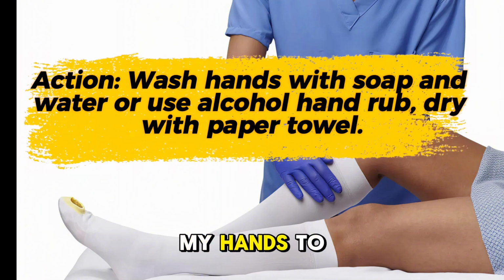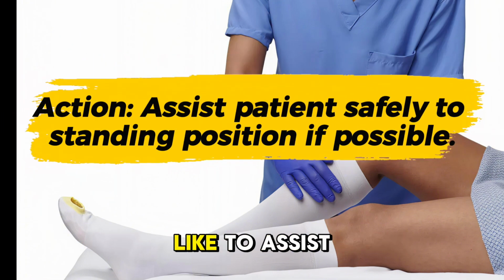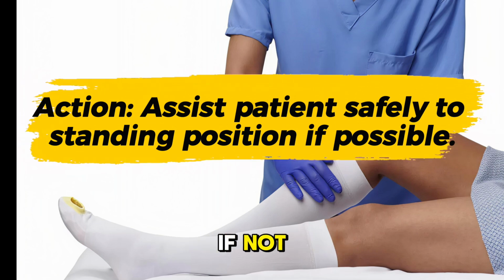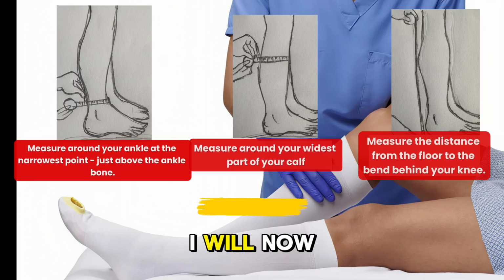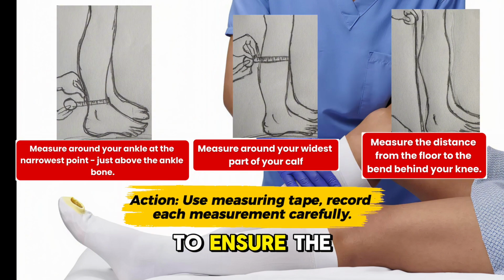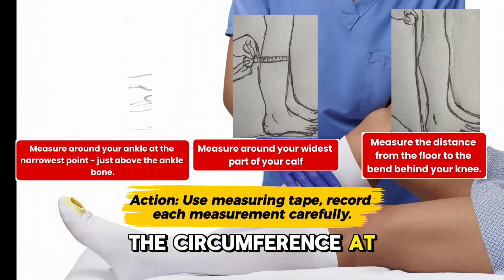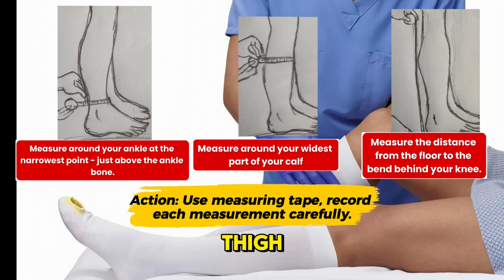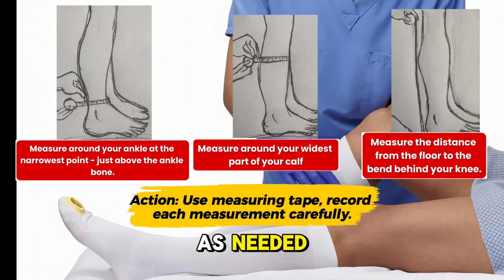First, I will clean my hands to maintain infection control. If you are able, I would like to assist you to stand to take accurate measurements. If not, we can measure while you are sitting or lying down. I will now measure your legs to ensure the stocking fit correctly. I will measure the circumference at your ankles, at your calf, and at your thigh. The length from your heel to the knee or thigh as needed.